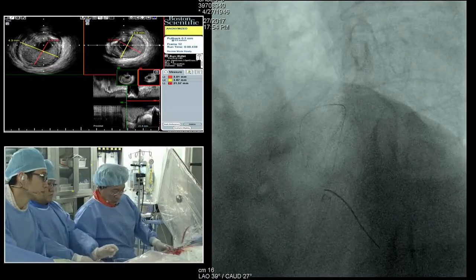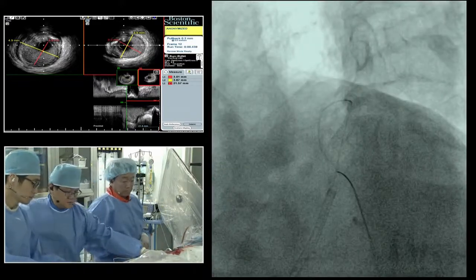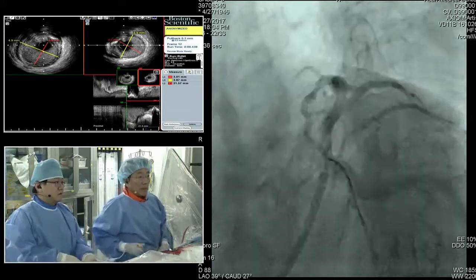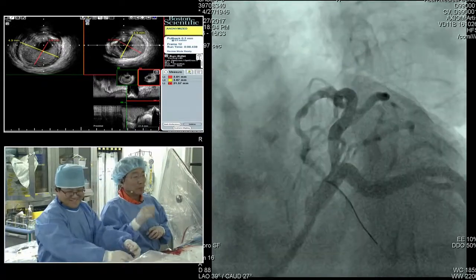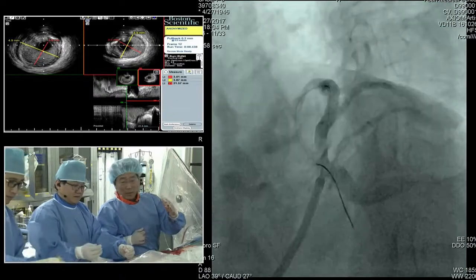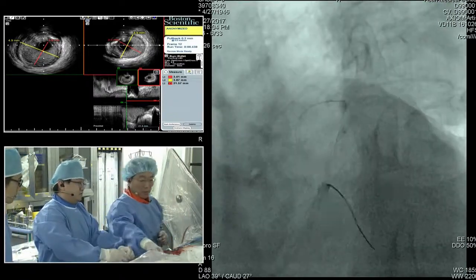Okay. Full shot. Oh, nice. And geographically it is almost perfect, right? I don't want more procedure for that. However, okay, we're going to do another wire, for crossing.